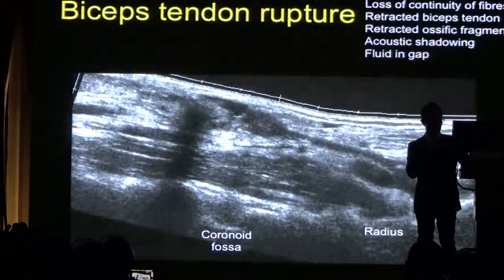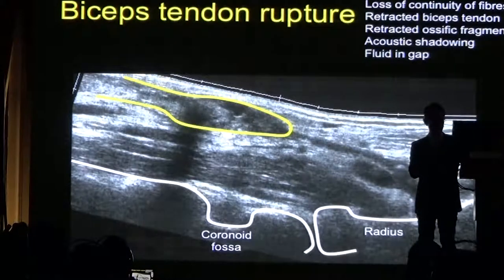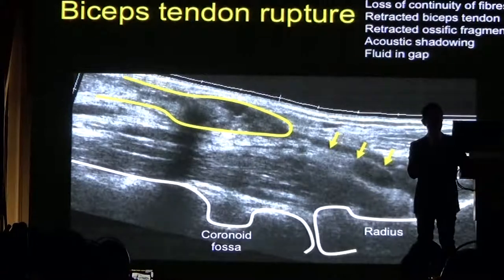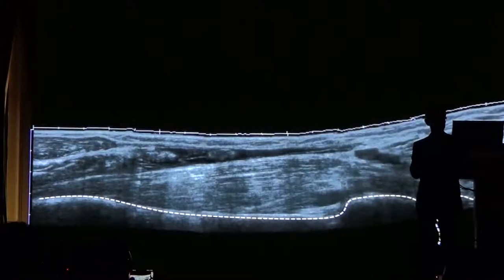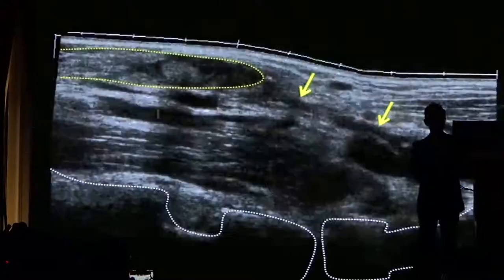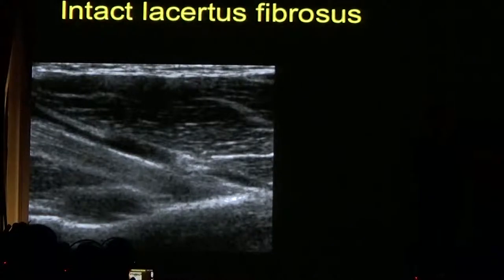Here is a complex image — the anatomy shows the coronoid fossa anteriorly and the radius. Where I'm expecting to see the biceps tendon, you can see fluid in the gap and the retracted muscle belly. Here is another example with the humerus and where the radial head would be — you can see the gap with marked retraction of the biceps tendon. All of these are done with extended field of view images to show the abnormality.